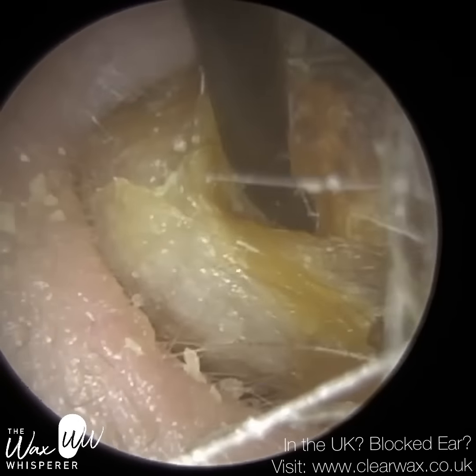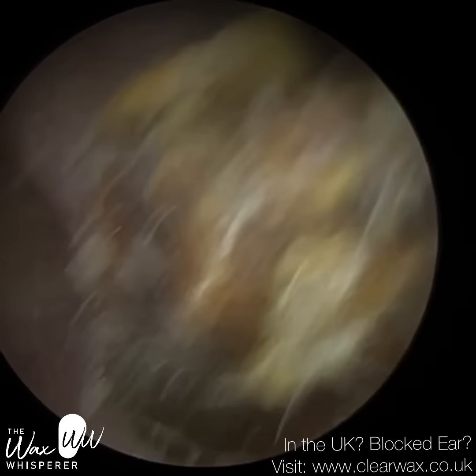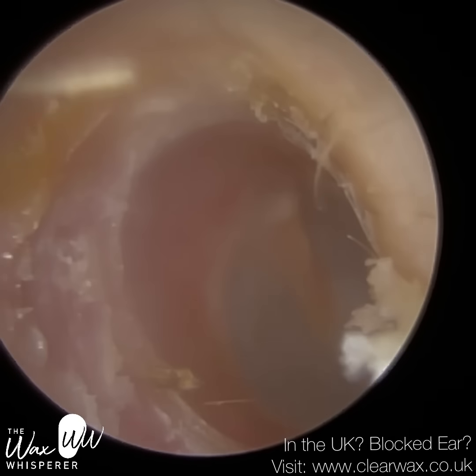And just near the entrance, you can see it's enveloped by a fresh layer of dead skin. The core has been oxidized, it's darker, so it's quite a substantial piece. You'll see some good still images if you continue to watch.